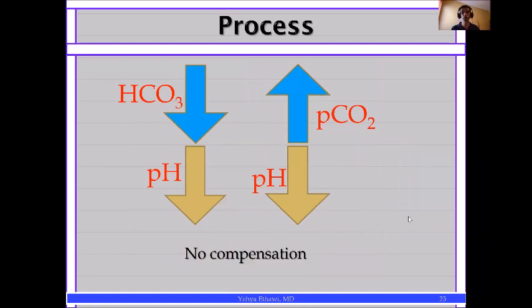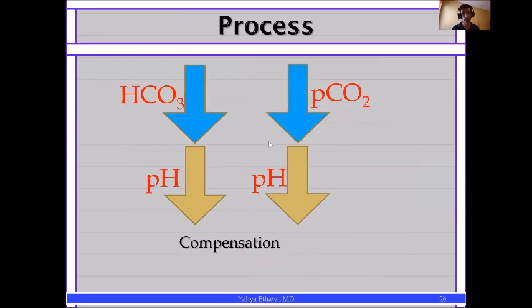Now, if they don't meet, it's not compensated. If they meet, it's compensated. Very important to remember that. You can see if they meet, they start to compensate.